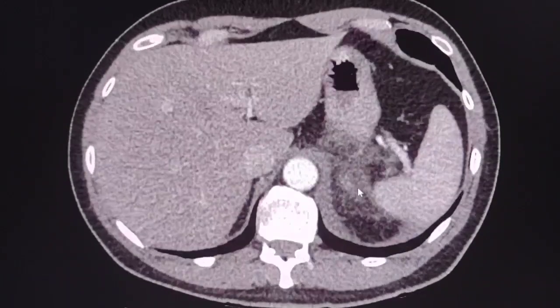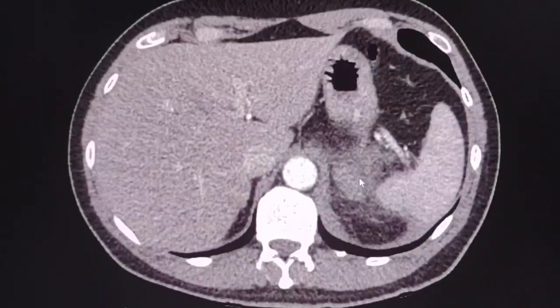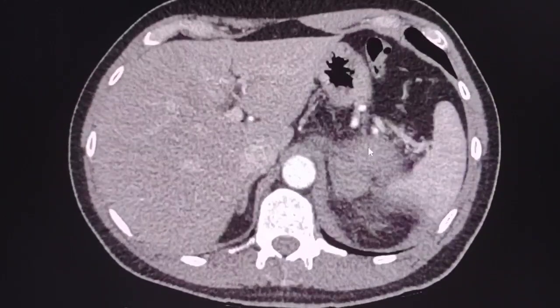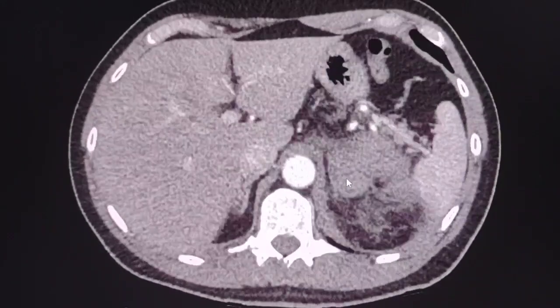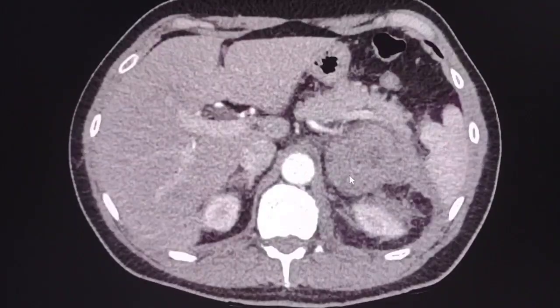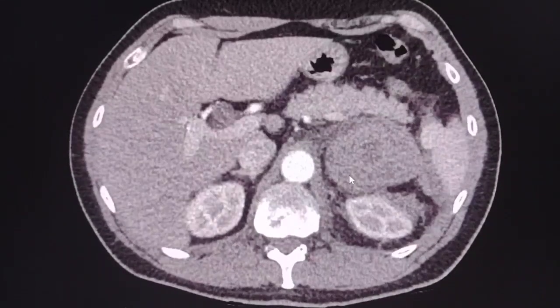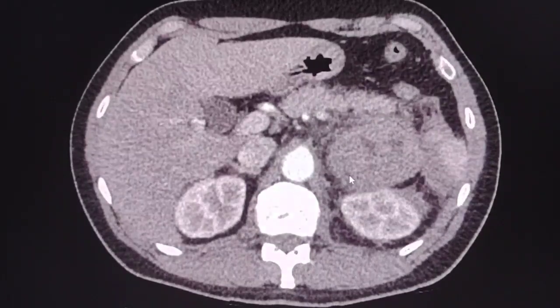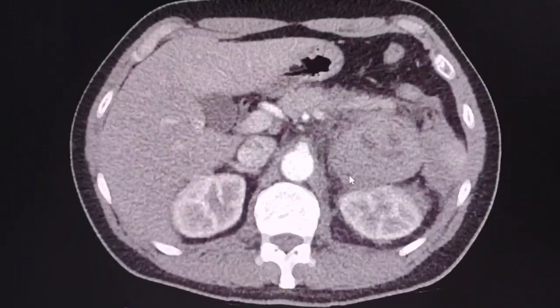Going upwards, this structure is likely part of the left adrenal, and we can see that the mass arises from somewhere in this region. Therefore, there is a higher possibility that this is a left adrenal mass rather than a left renal mass, as was initially assessed.